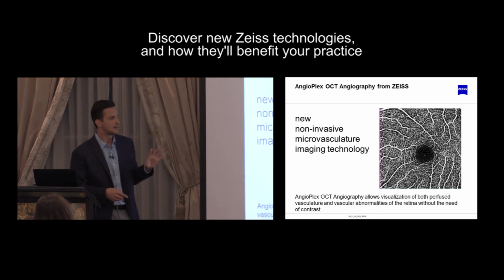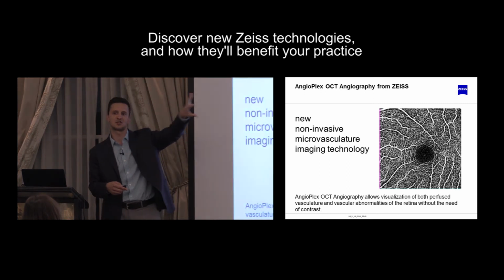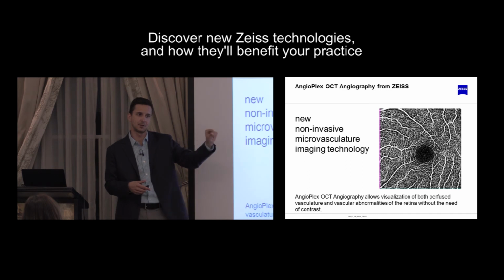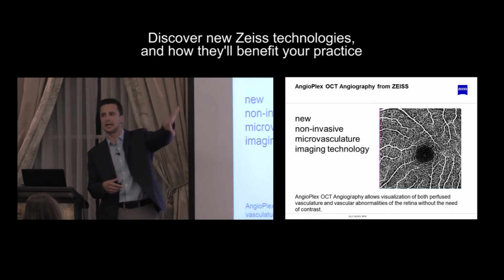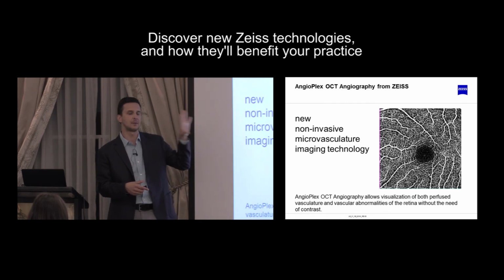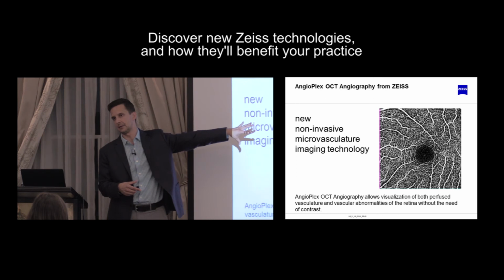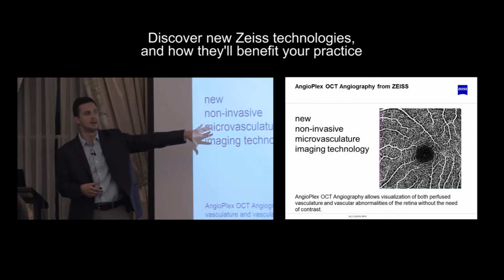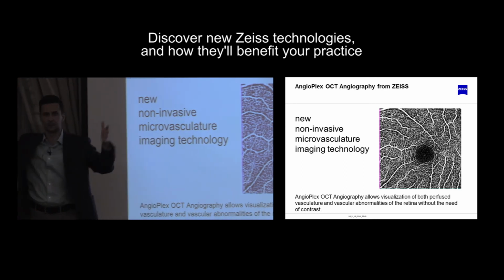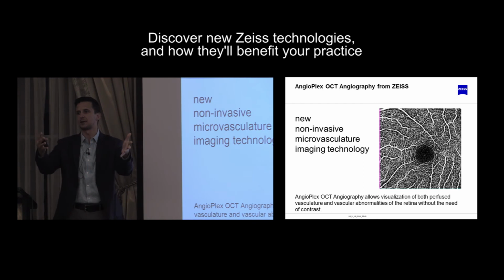What's unique about this is that on the other side there's another image that's your structural map, your en face image, so you can dive into the tomogram. You can get an angiogram and a tomogram of the retina at the same time. I will tell you this has grabbed patients' attention more than any other image or device we've brought in, because you can overlay it on a black and white fundus image and pop it up on your screen, and they know what they're looking at in a heartbeat.